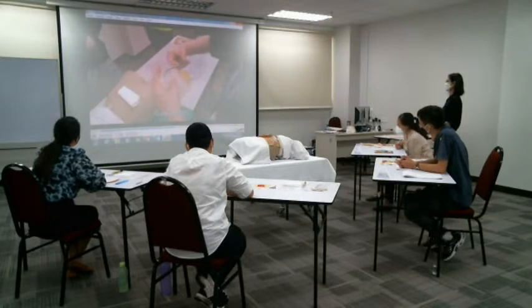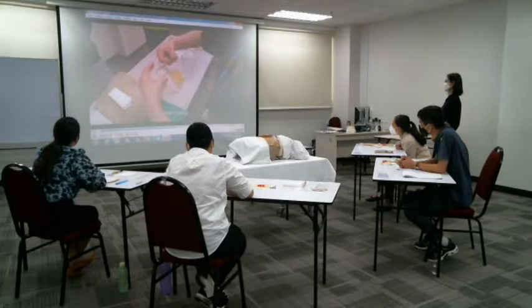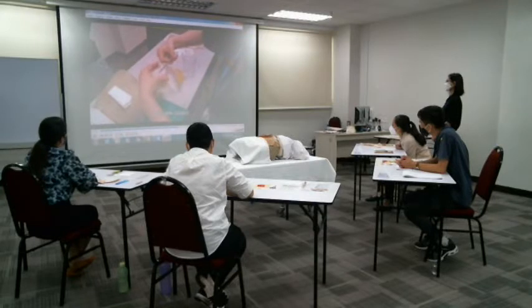If I cut too big, then I cannot save it because it will be spoiled. If I cut too small, I can further trim it. Okay, so be very careful in cutting.